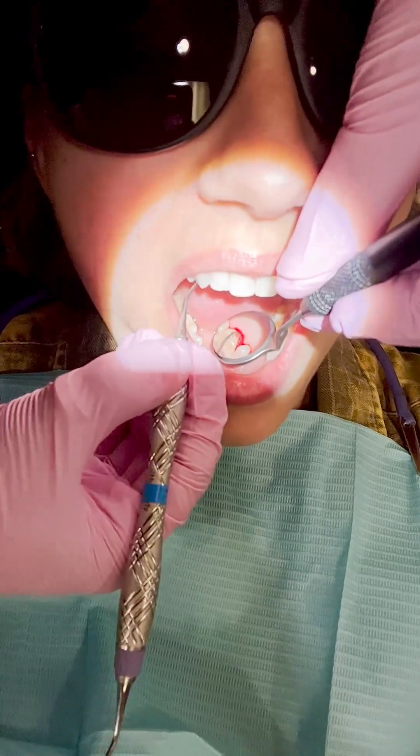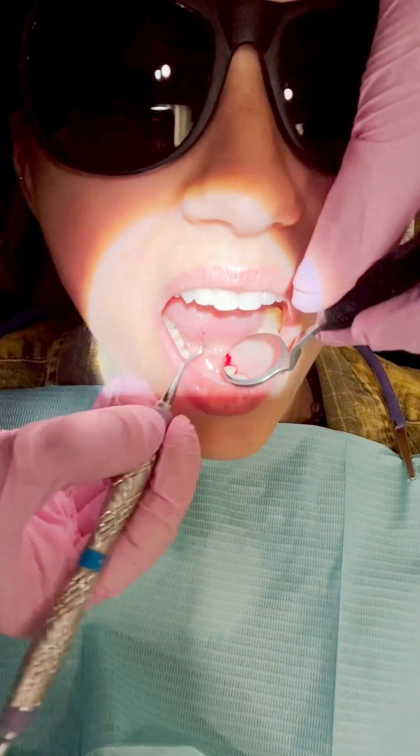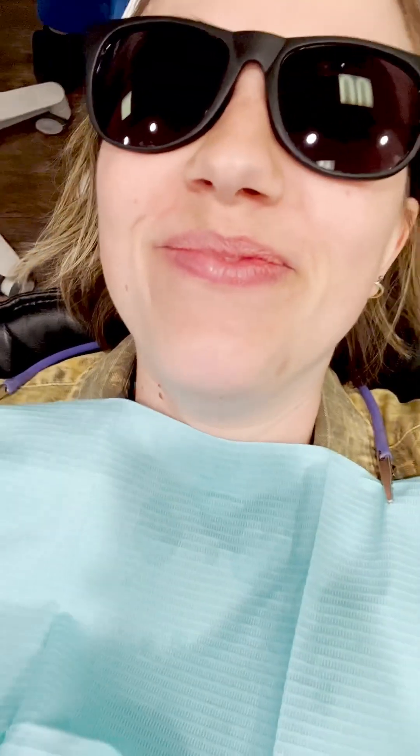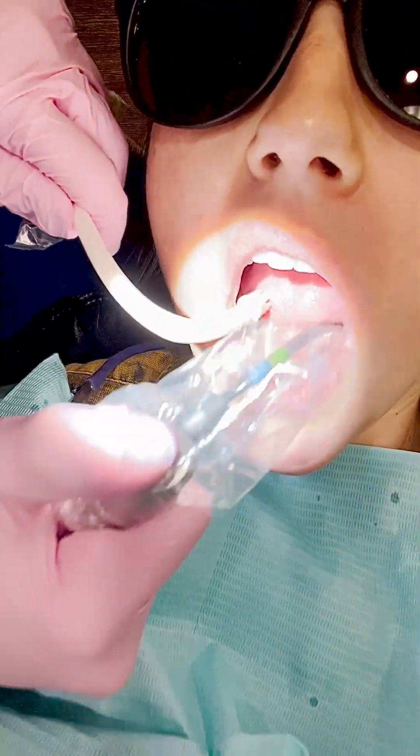Right here there's a lot of bleeding because there was a big click of buildup and tartar. You can hear my sister laugh — she was laughing because she could feel the click and asked what it was. It's the buildup. You should floss.